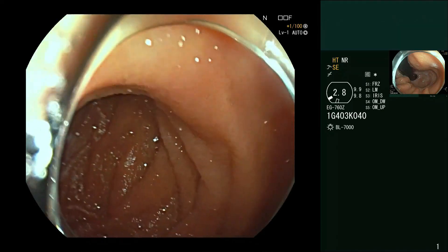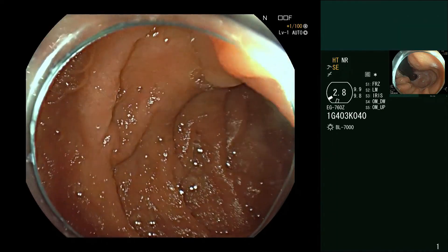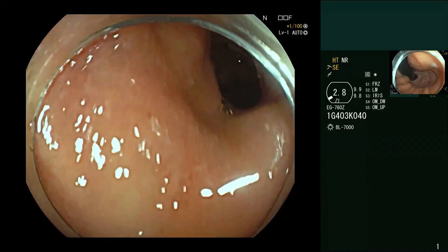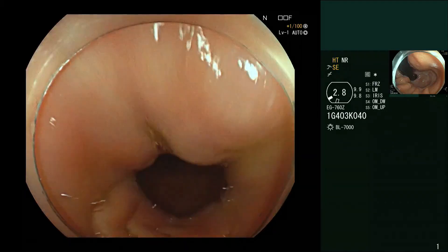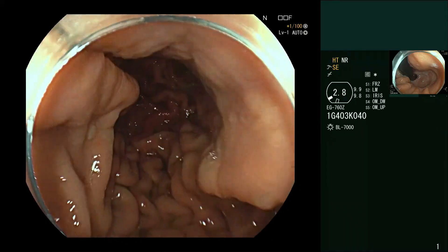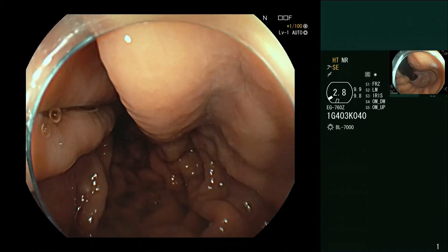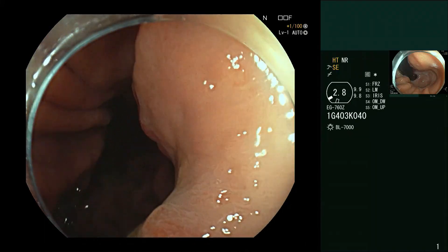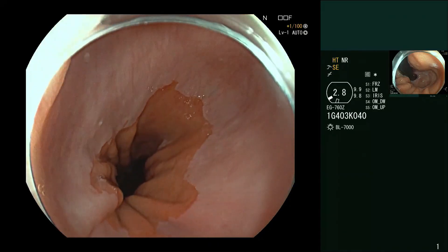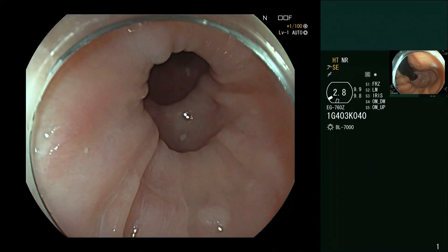You can get some surrogate information about whether the patient is taking their PPI by looking at the duodenum, and of course all the other things we do when looking during gastroscopy are very important. So that's how to look at the gastroesophageal junction and how to investigate the esophagus after an achalasia intervention.